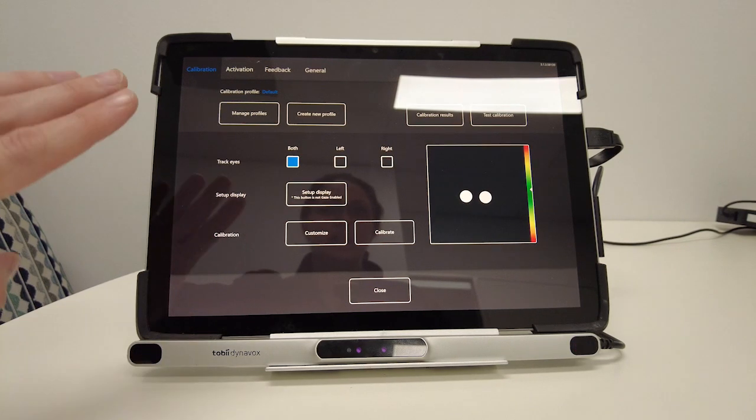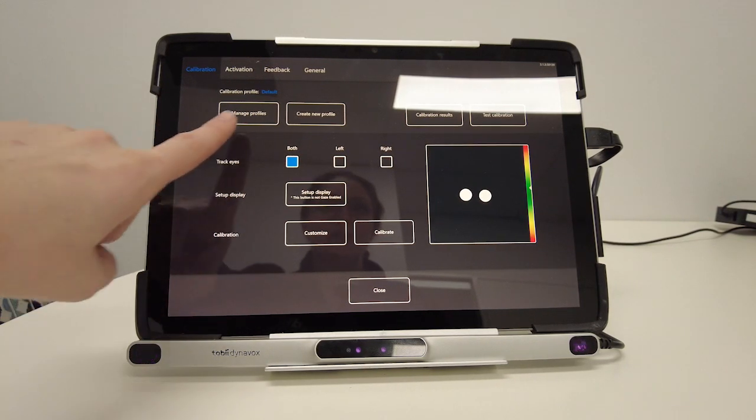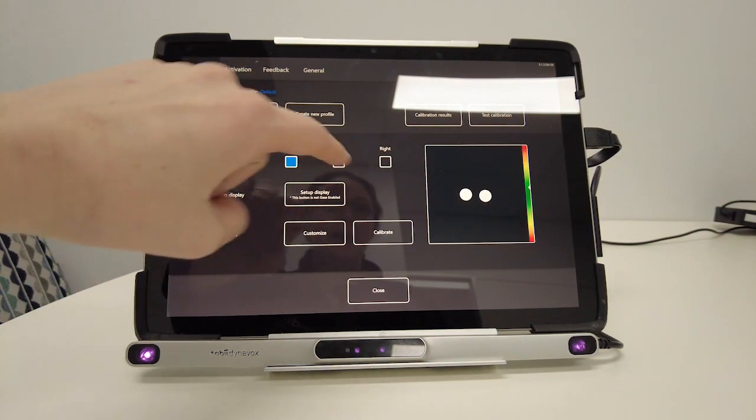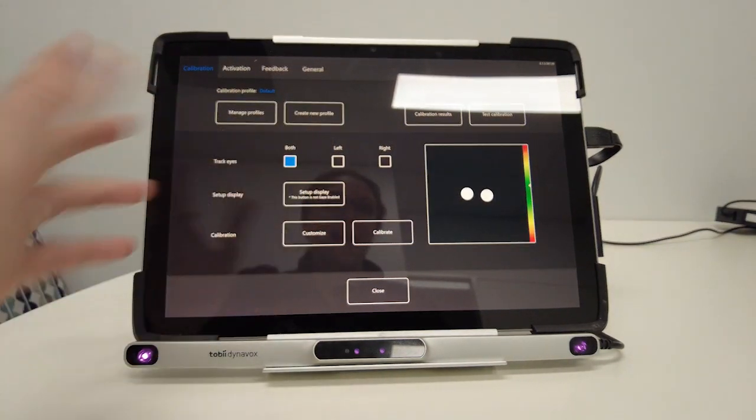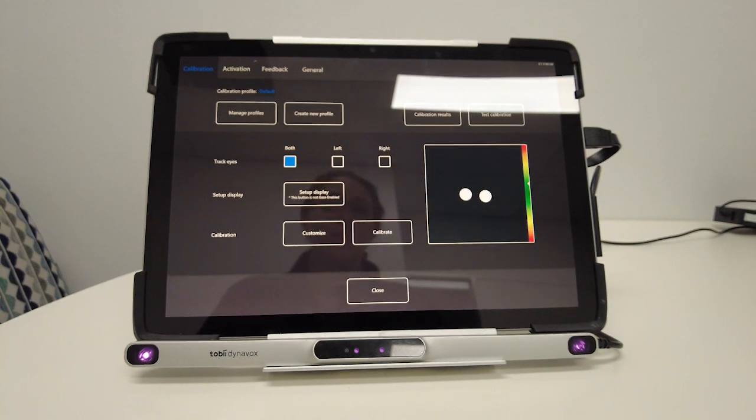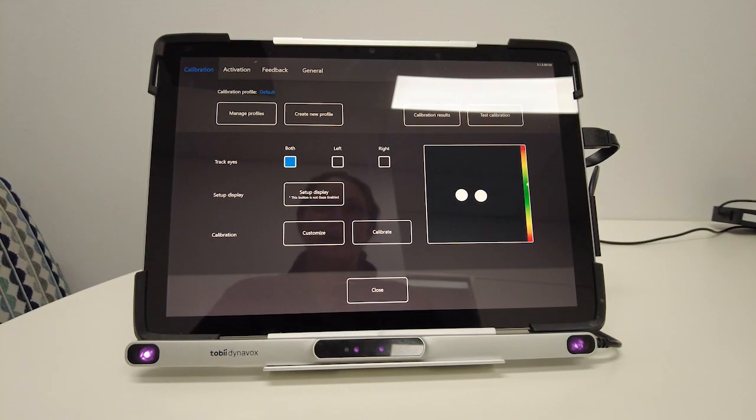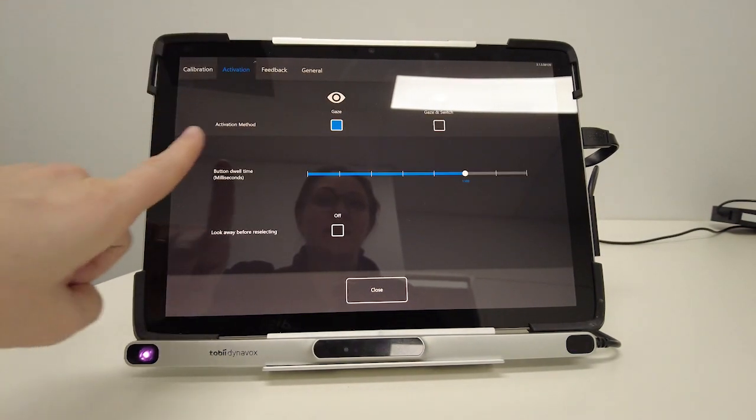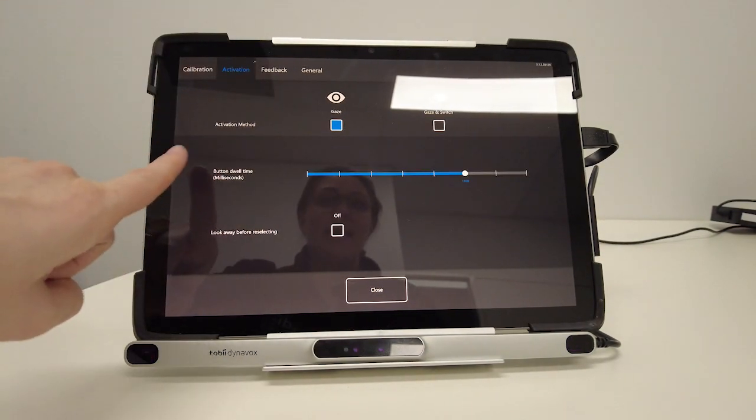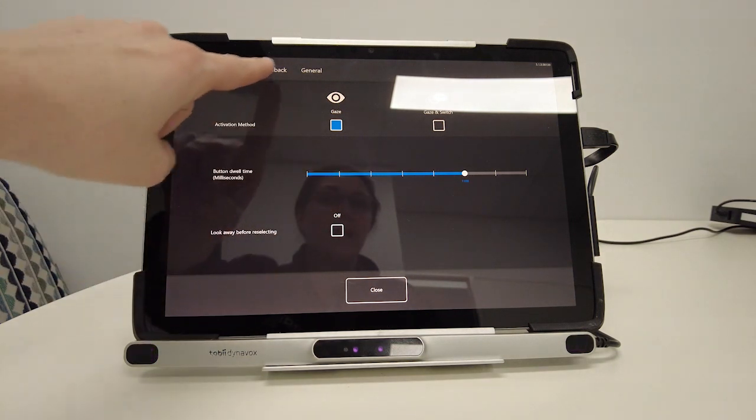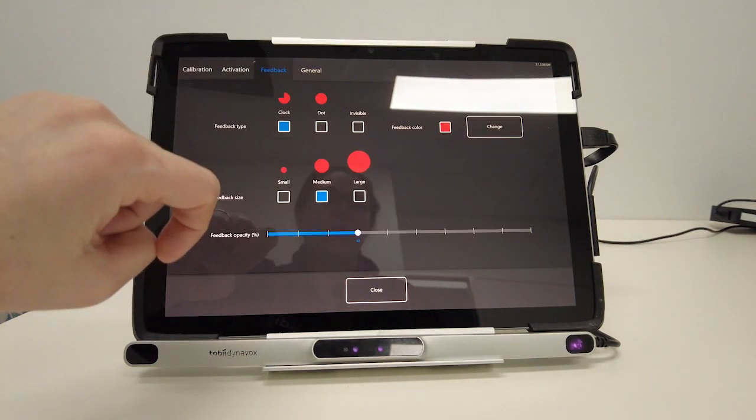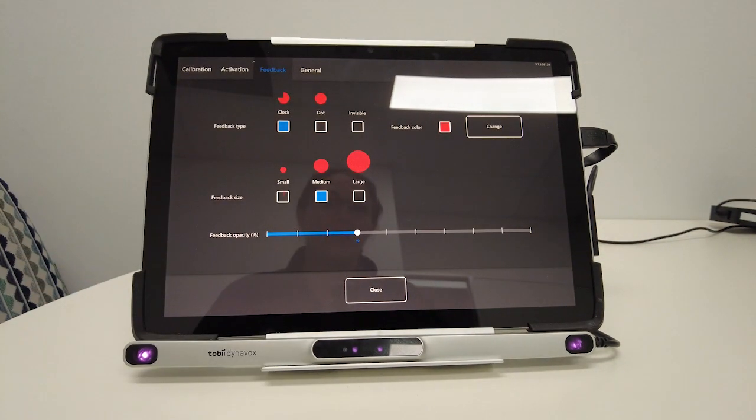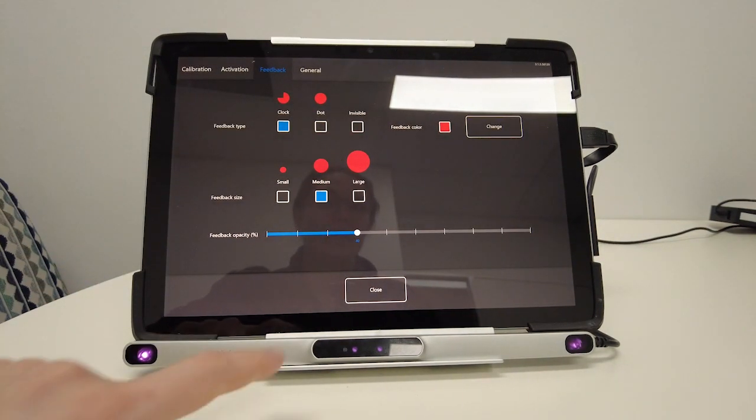I can also use this page to set up user profiles to calibrate for a new user and change settings such as dwell time as well as the sort of visual feedback that a user is getting.